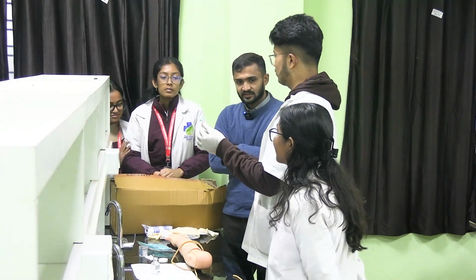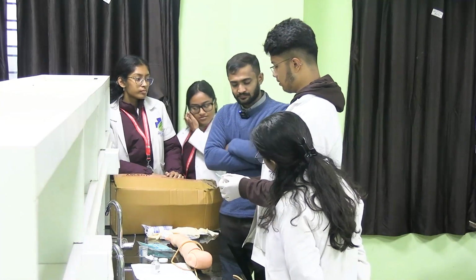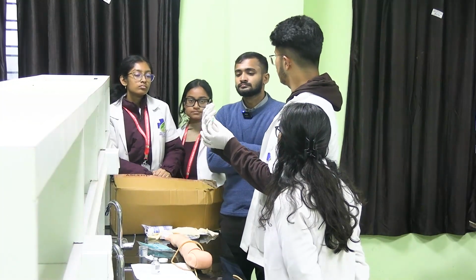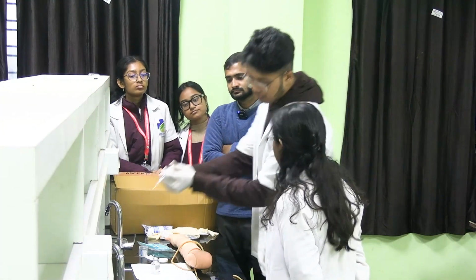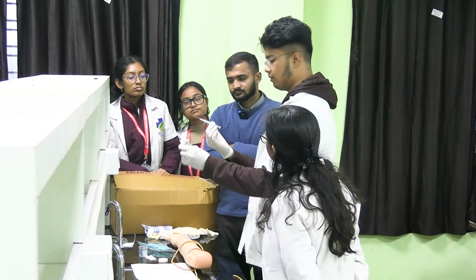If the syringe and the needle are separate, like this, then you shouldn't touch the tip of the syringe. Okay. Then, sir, I'll take the plunger to 0.1 mark extra, sir. I'm ready, sir, then I will take the medicine.